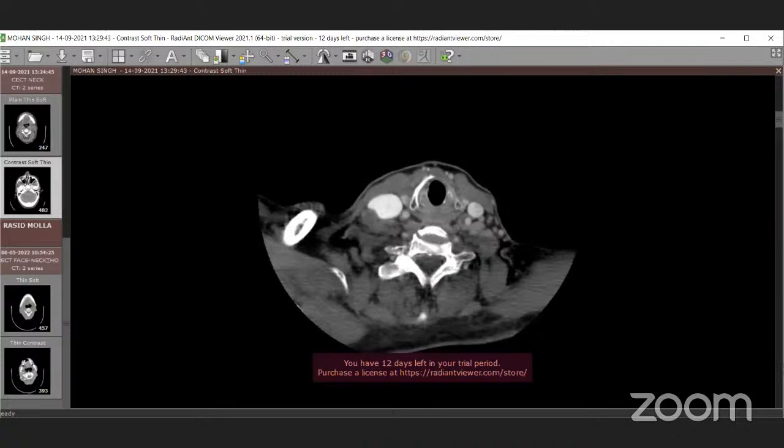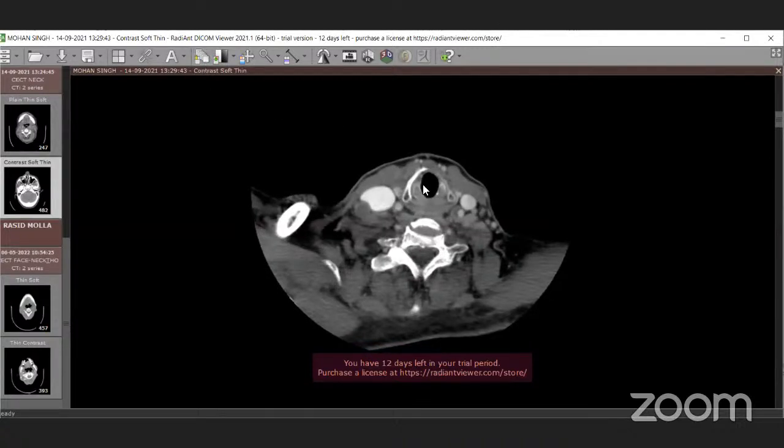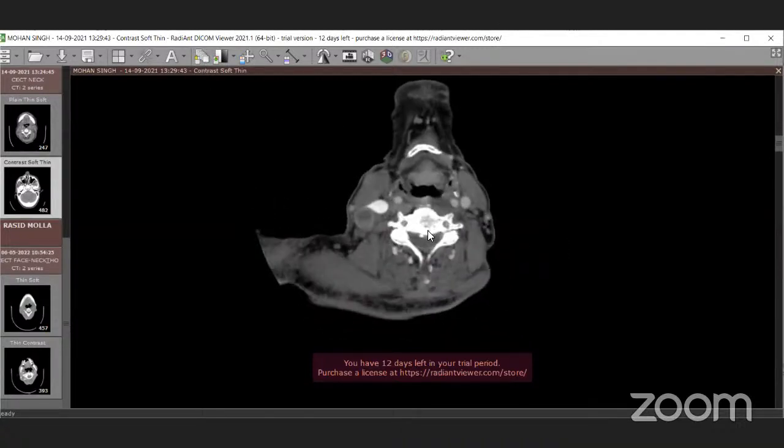So as far as I remember, Dr. Saili asked, what is the superior extent of larynx? Okay, I guess this question is to be dealt with in the next class. The larynx is to be dealt with in the next class. And there was another question by Dr. Abhay, as far as I remember, that he asked about the boundaries of pyriform sinus. Extent of the pyriform fossa, what are their boundaries? Could you please just show us? Yes, I'll repeat it once more, whatever we discussed.